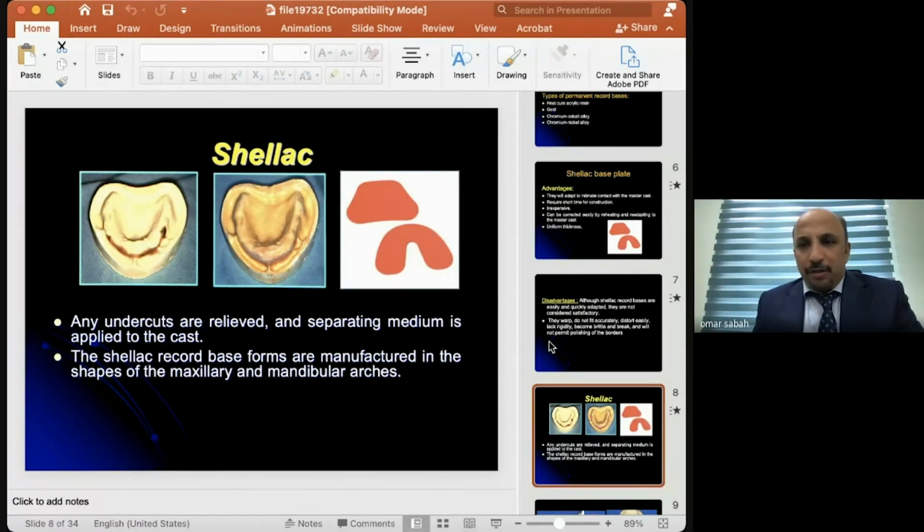Okay, what does shifted mean? It's asymmetrical, it means not in the correct way, we say a bit crooked. Okay, meaning the upper cast's midline compared to the patient's original arch, the original arch is rotated, okay, to the right or left.